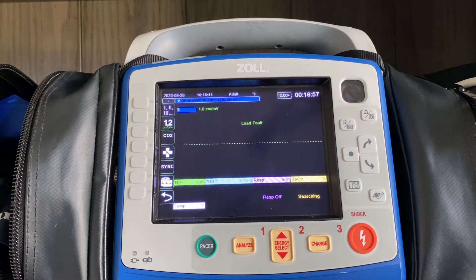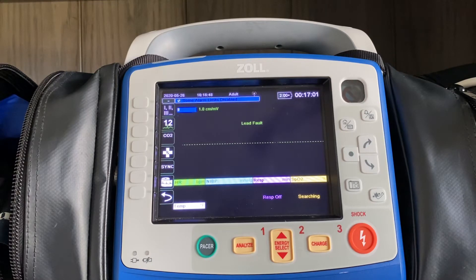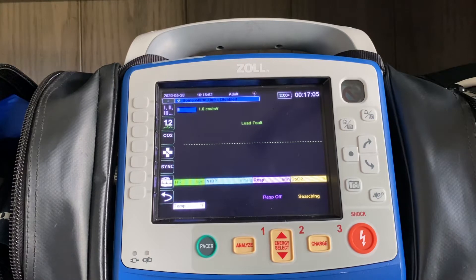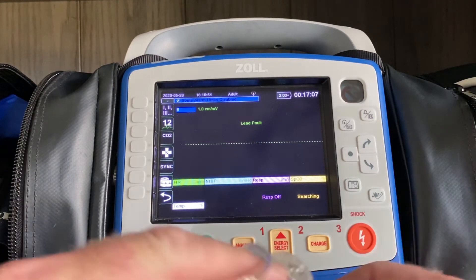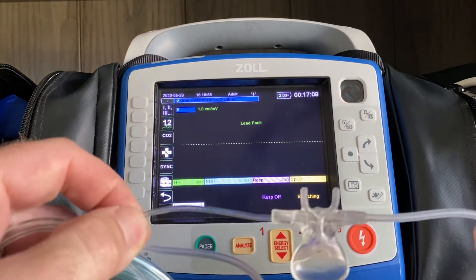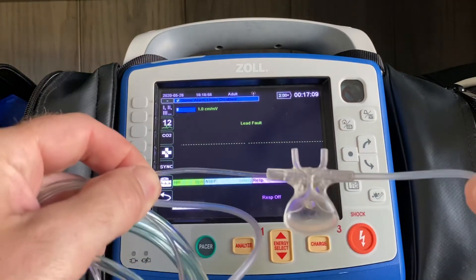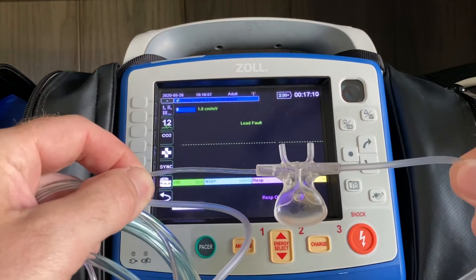The next thing we're going to take a look at is the use of capnography on respiratory distress in sepsis patients. In that case, you're going to be using this disposable piece — this oral nasal cannula.